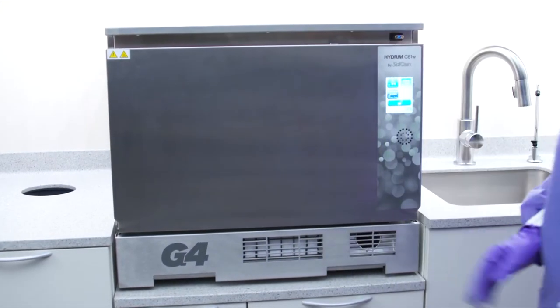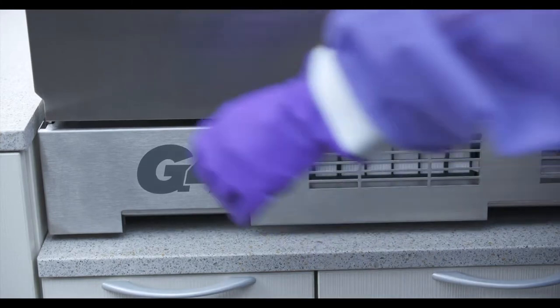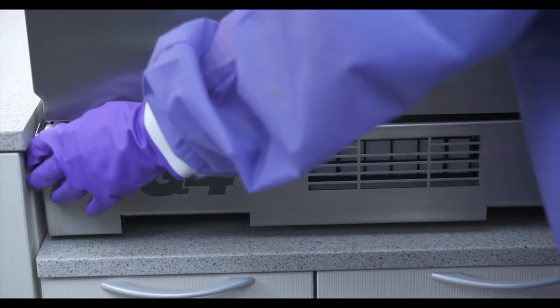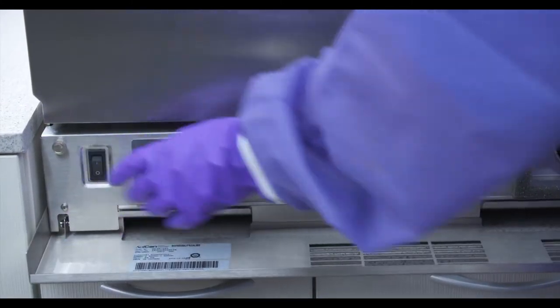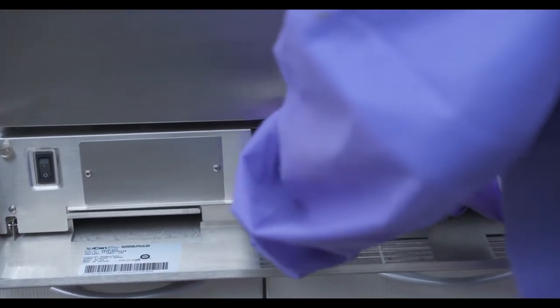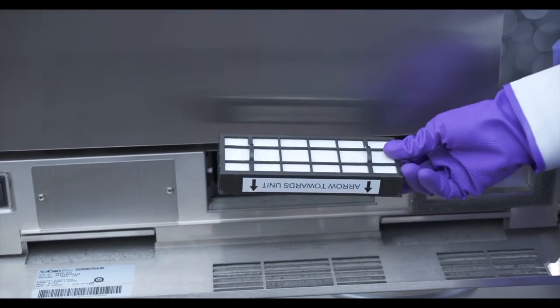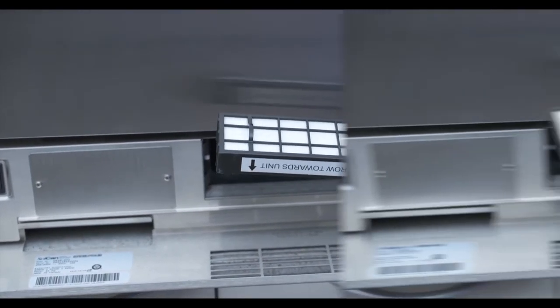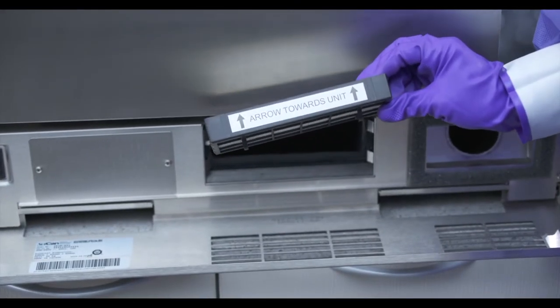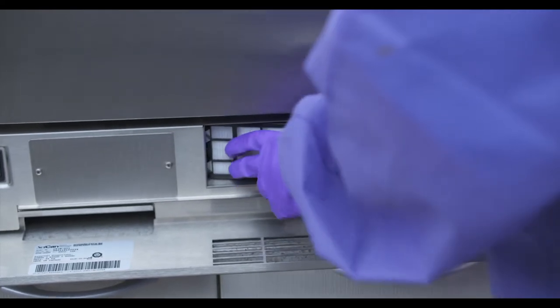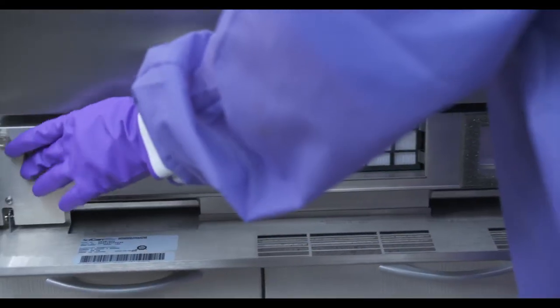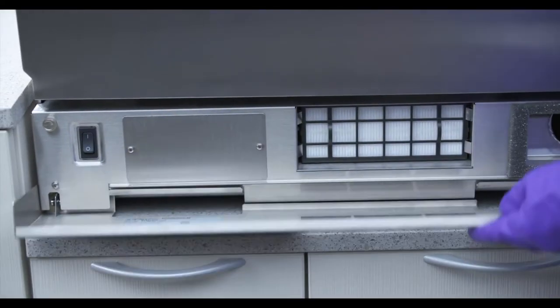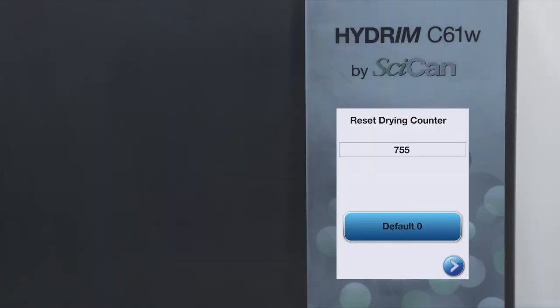You will see a message to replace air filter after every 750 cycles. HEPA filter is located inside the kick plate below the front door. Replace the filter and reset the drying counter to zero.